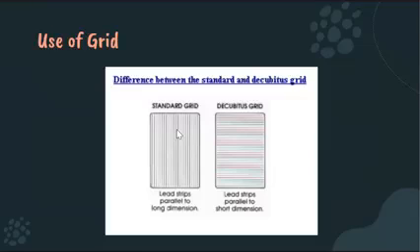Okay? So it is also important to note that the grid is positioned in between the patient and the image receptor so that only the parts of the primary beam enter the image receptor and not the scatter radiation, because the main function of your grid is to control the scatter radiation, therefore increasing the quality of your image. So going back, the standard grid or the normal grid has lead strips and interspace material running lengthwise.